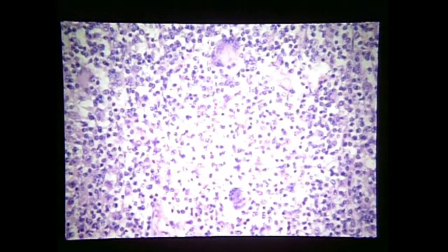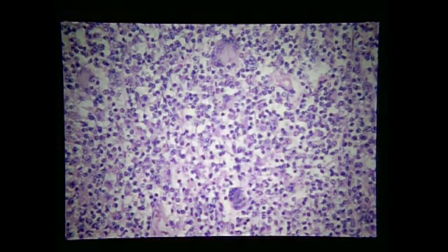Here, the presentation of the subcutis being involved in the formation of areas of nodules that microscopically showed two populations of neoplastic cells. One, a lymphocyte of expected size, and then more histiocytic cells that frequently also had evidence of multiple nuclei. So it's a primary lymphocytic and then also histiocytic component that is involved in the development of the cutaneous form of lymphosarcoma.